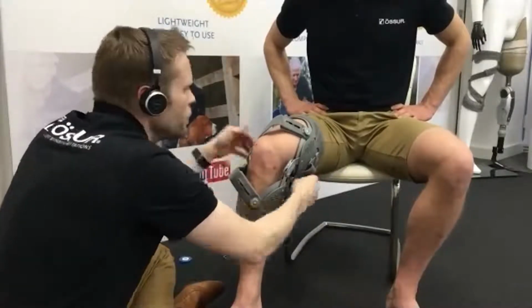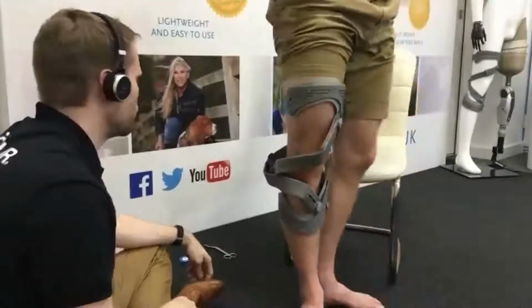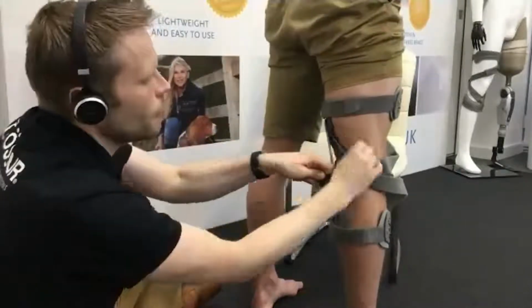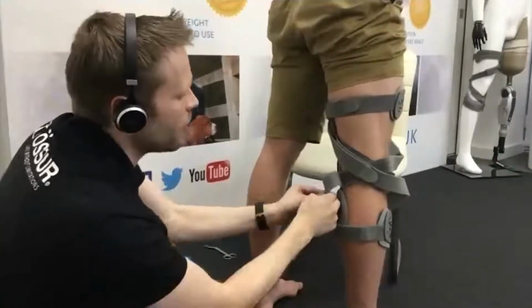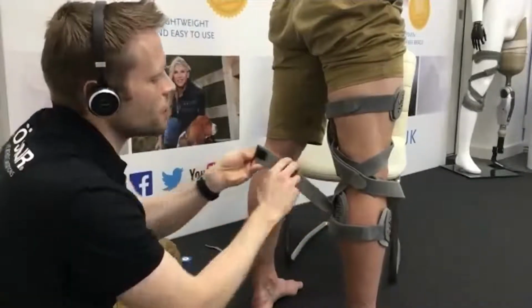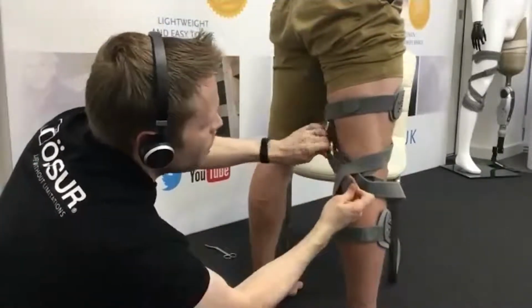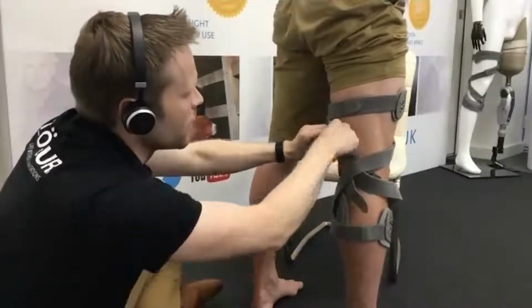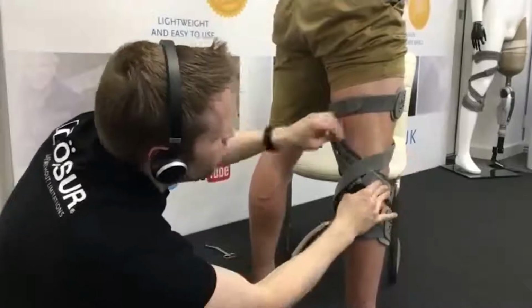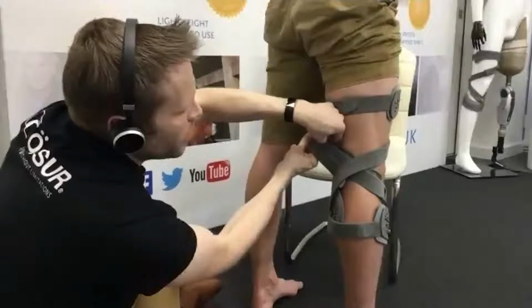Okay, so these are a little bit loose at the moment, but what I'm going to do is get Pete to stand, turn her face the other way, and I'm just going to tighten these up either side. So what I'm going to do is I'm intentionally making an error here, which I'll come back to in a moment. So I'm just tightening these up. You can see these are incredibly long. Okay, so we're getting these nice and tight, and it's just sitting away from the skin. And as I'm doing this, I'm just making adjustments to this popliteal pad, adjusting it either side and just bringing it into position like that.